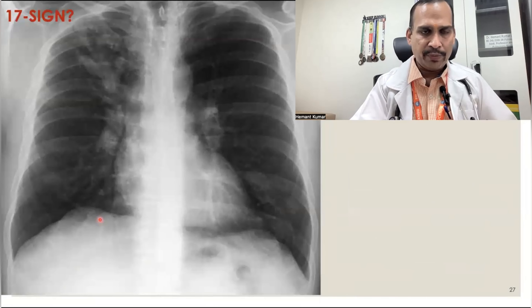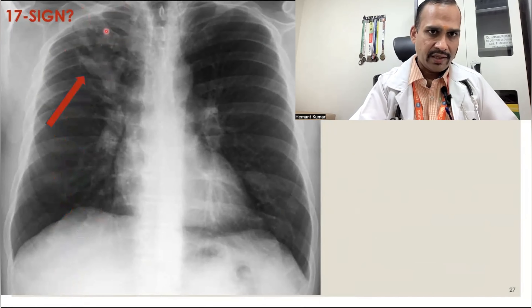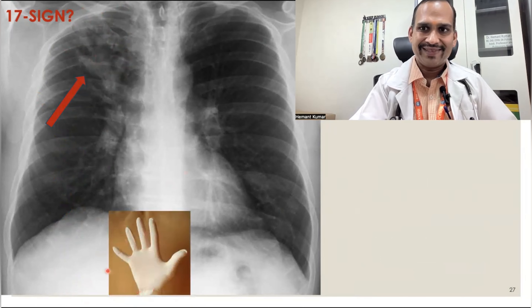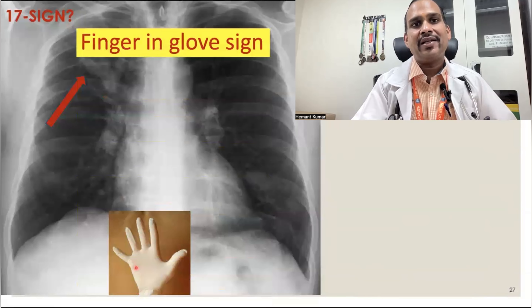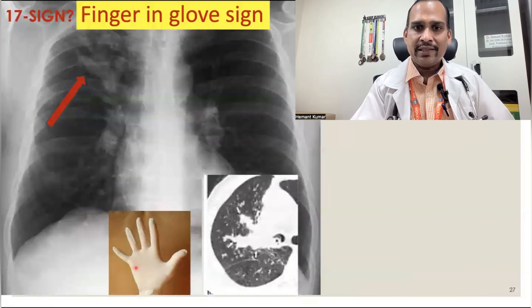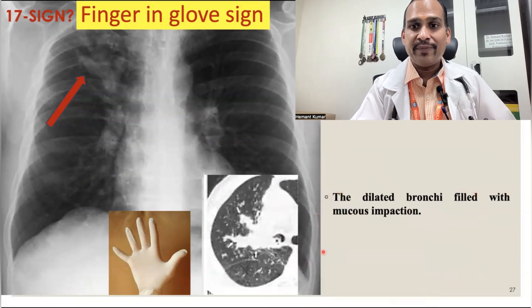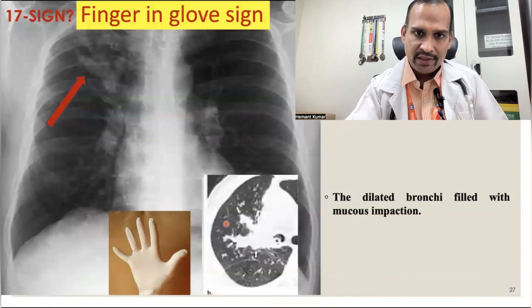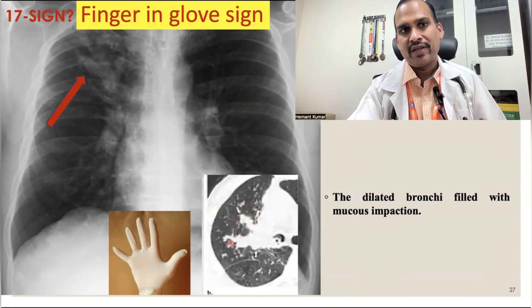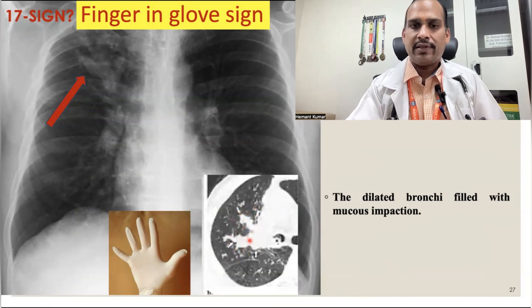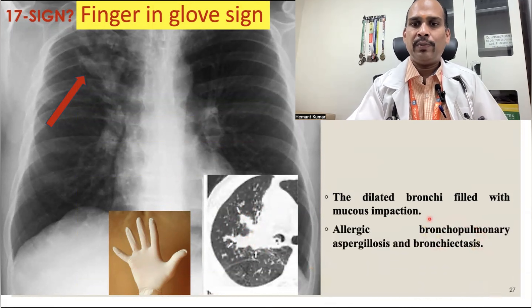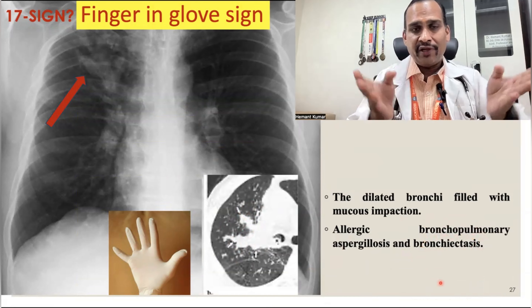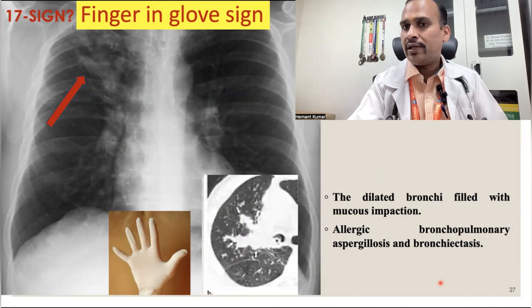Sign 17 is the finger-in-glove sign. You can see opacities in the right upper lobe resembling fingers in a glove. This is dilated bronchi filled with mucus. On CT scan, you can beautifully appreciate this. It is seen in ABPA — allergic bronchopulmonary aspergillosis — and in bronchiectasis. Whenever there is dilatation of airways filled with mucus, it produces the finger-in-glove sign.